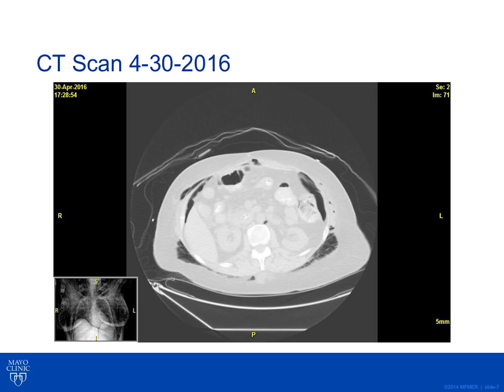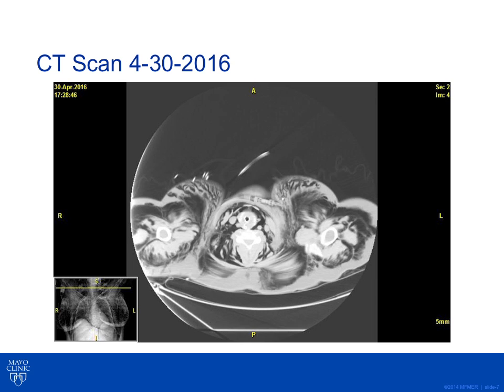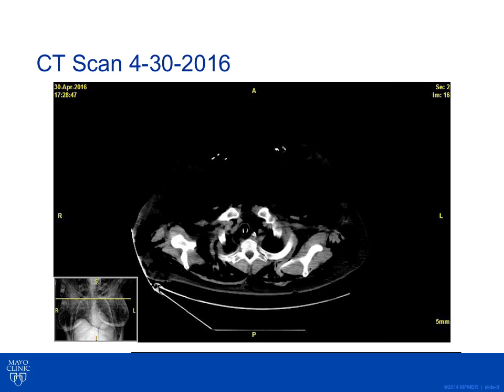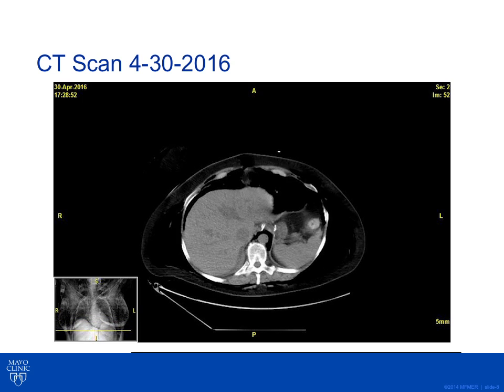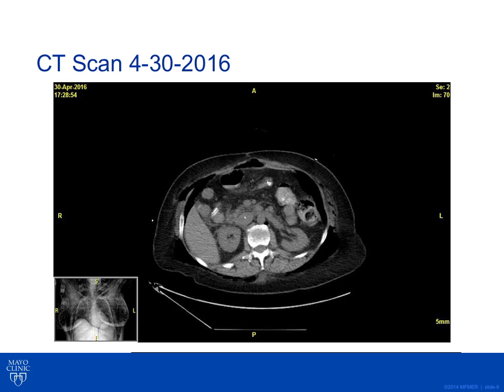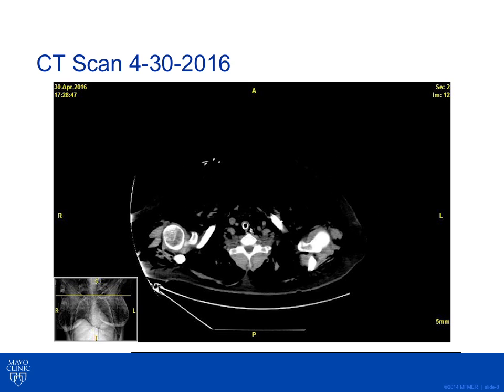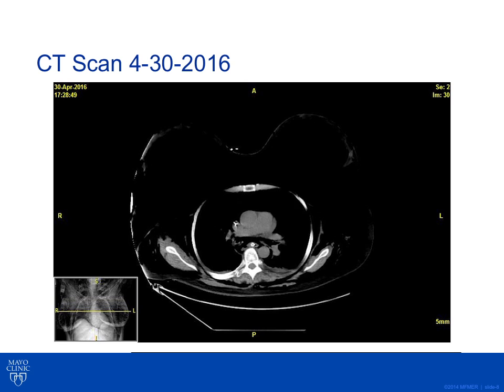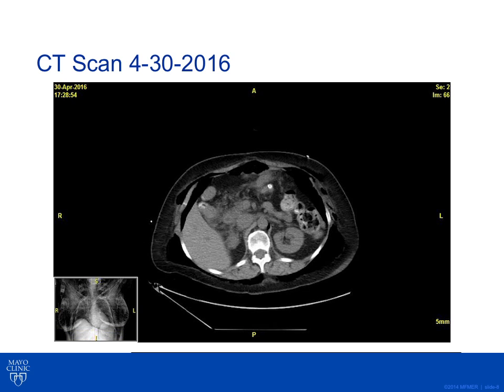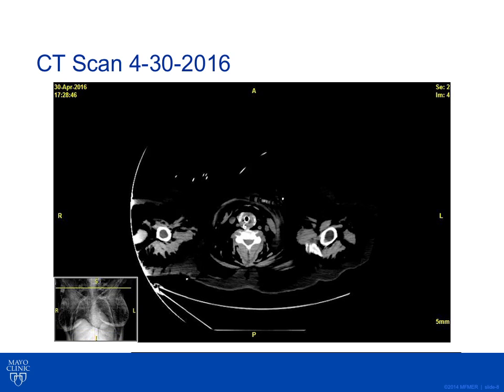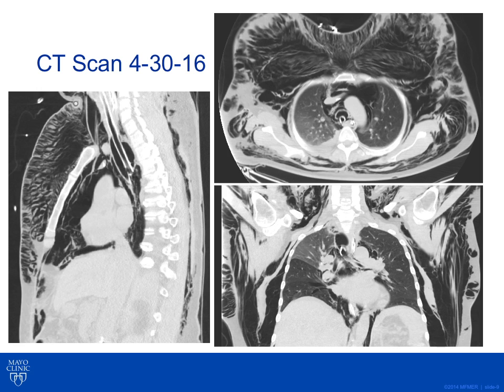The massive subcutaneous air made it very difficult to visually inspect the patient. In contrast to the lung windows, the soft tissue windows clearly demonstrate the presence of the endotracheal tube. The endotracheal tube and the nasogastric tube can both be seen. The endotracheal tube is clearly seen to exit from the trachea on the coronal, sagittal, and axial views, which show that the tube is exiting the membranous posterior aspect of the trachea.